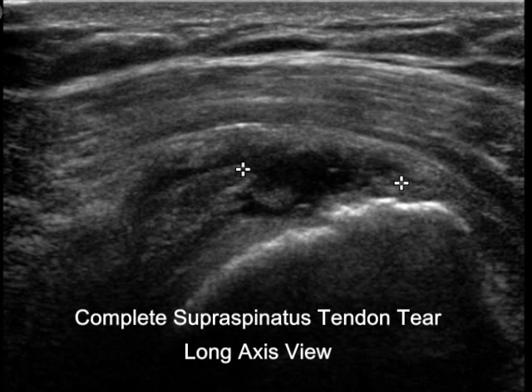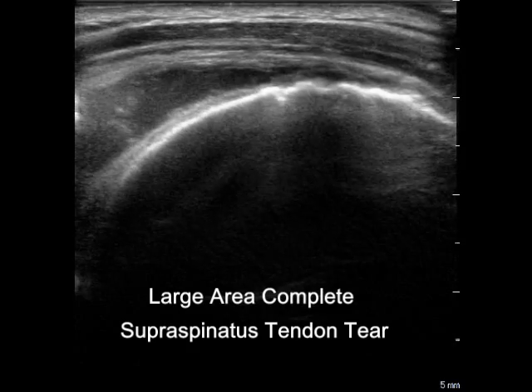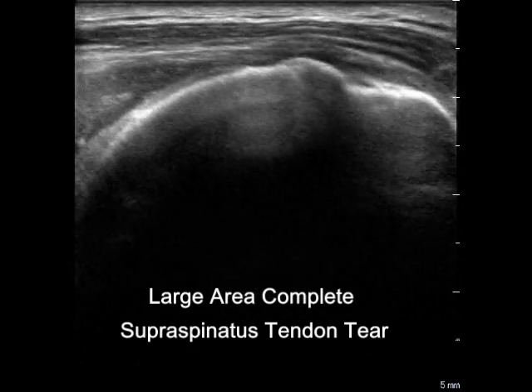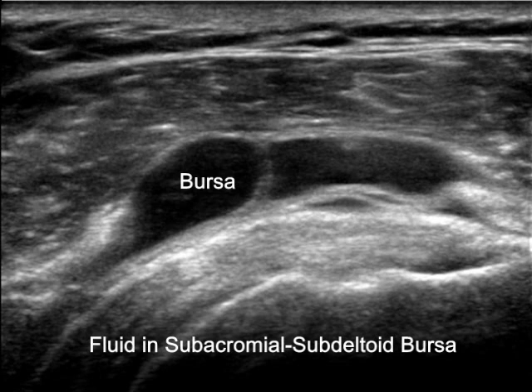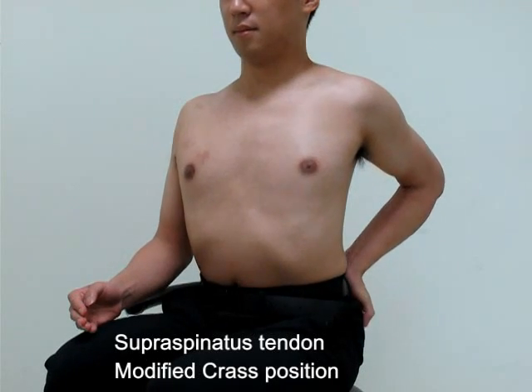Be aware of any change in the morphology and echogenicity of the tendon to determine the pathologies. In this cut, the deltoid muscle, subacromial subdeltoid bursa, and hyaline cartilage can also be seen.